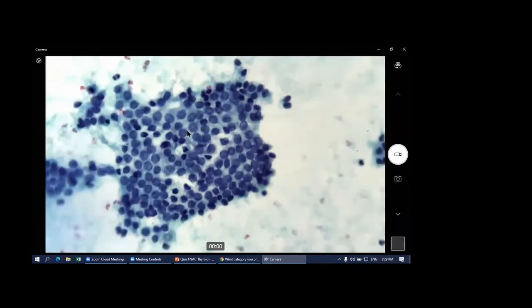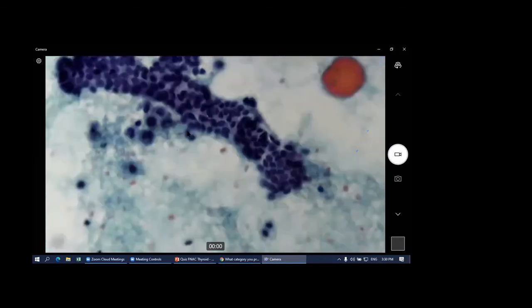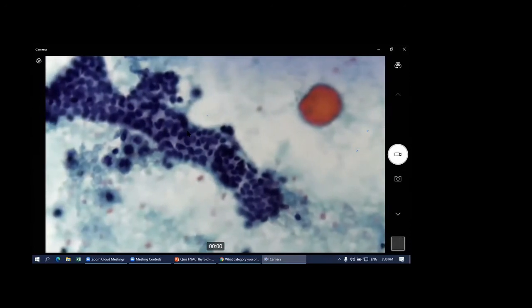Can you see that? Give us a minute. It's there, but it's not clear yet. Okay, you can see it now, right? And I can show you another fragment. Small fragments, but it is actually very typical. You can actually see from here already how the pattern looks.